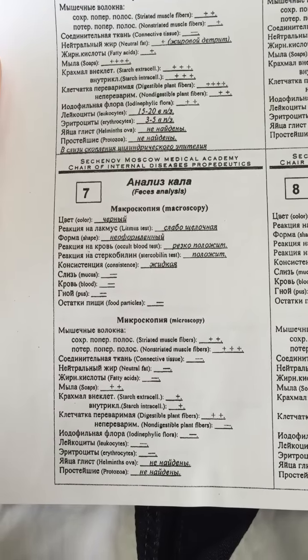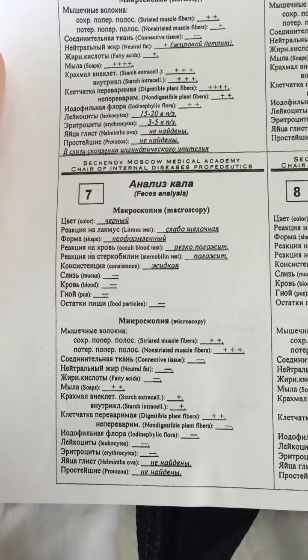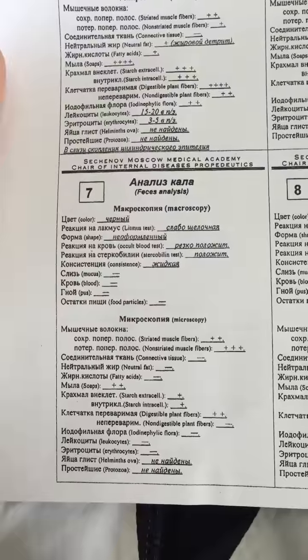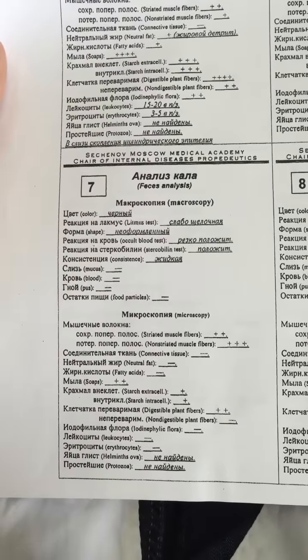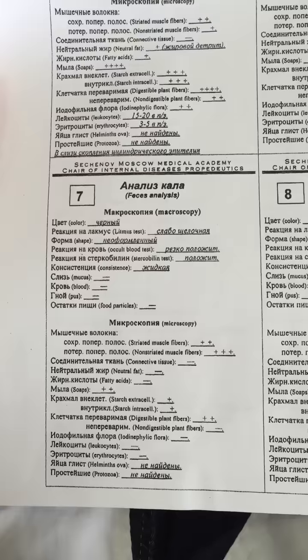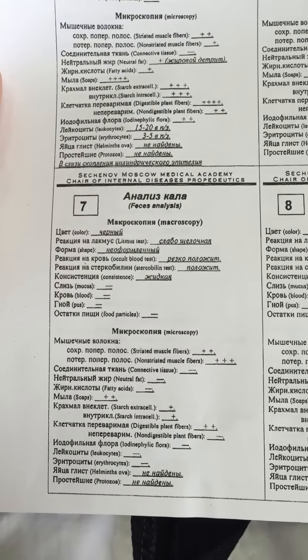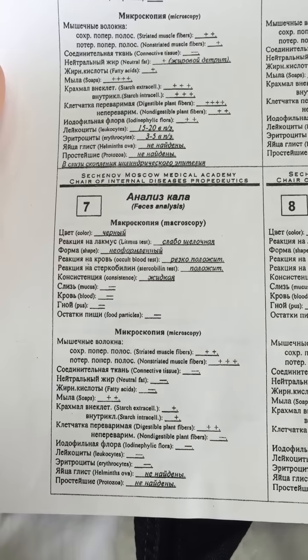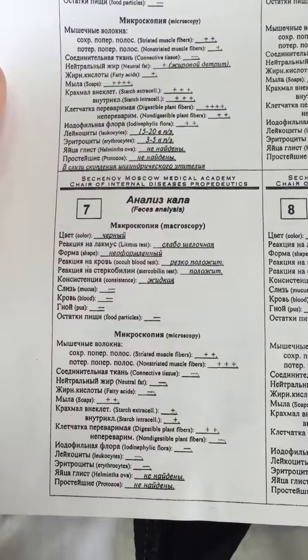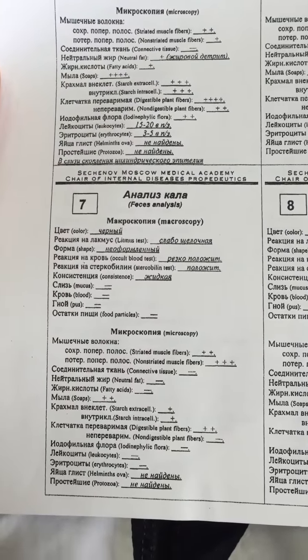Microscopy, a little bit muscle fibers, also soaps, and digestible plant fibers. What does it mean? Hemorrhage? Yes, usually we say upper gastrointestinal bleeding, upper, not lower parts of bowel. So because the black color of feces, yes.